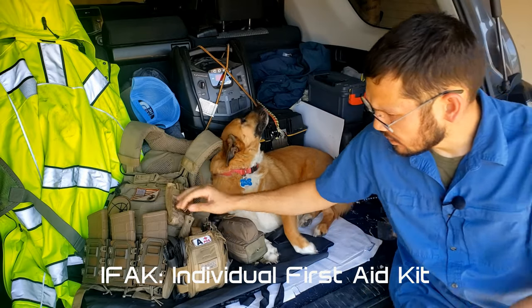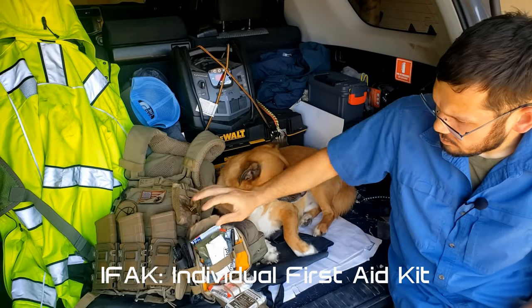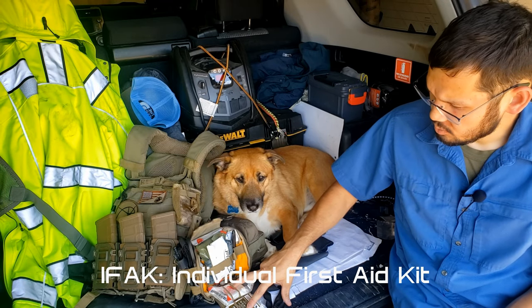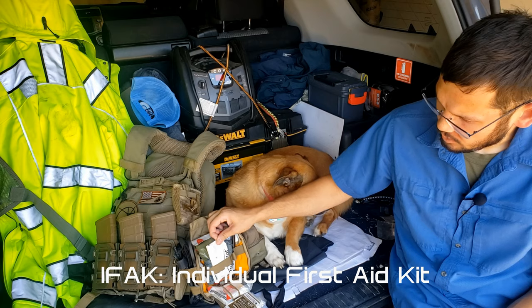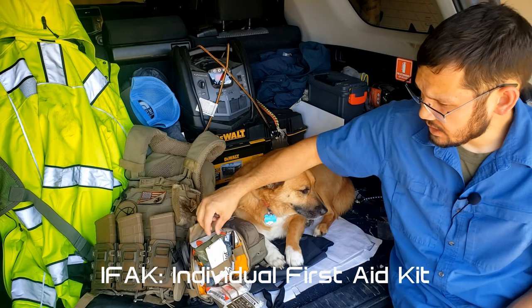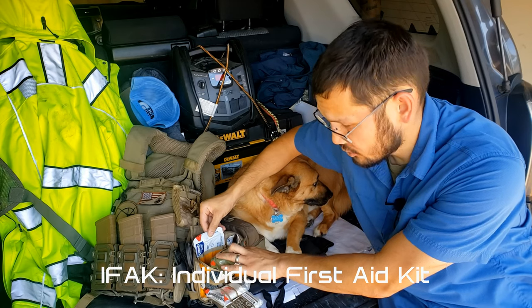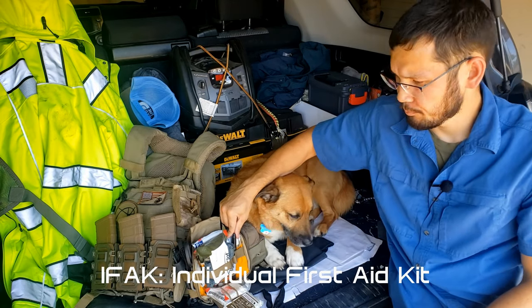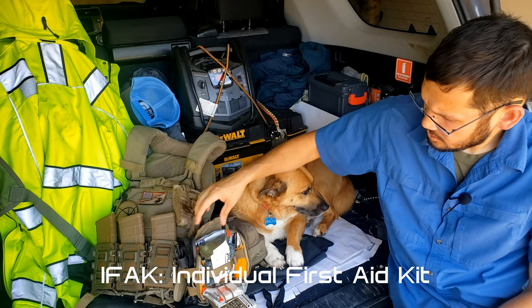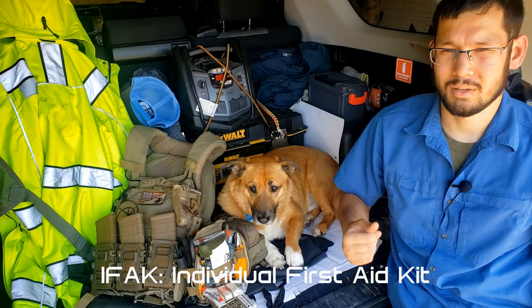Okay, so I have one here. This particular kit, when I'm wearing the plate carrier and I open this, it's all there at my fingertips, and it doesn't just fall out, right? So I've got two compressed gauze rolls, hemostatic gauze, QuikClot, two packets of nitrile gloves, some medical tape, a flat trauma bandage, compact chest seals, and a nasopharyngeal airway. Shears and the tourniquet. So the trauma shears and the tourniquet, you'll notice commonality between the kits. Shears and tourniquets have got to be accessible quickly.